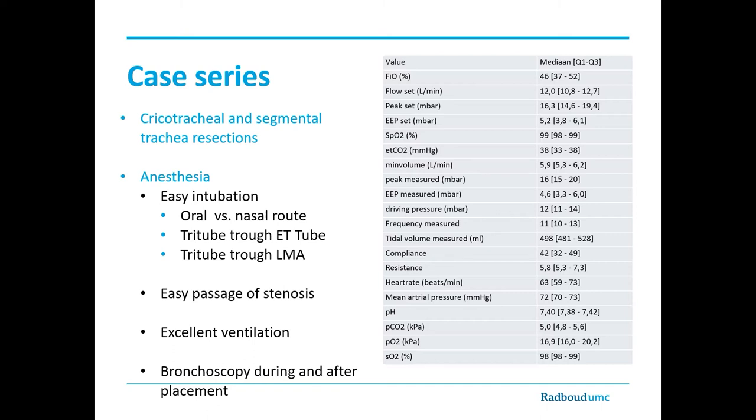and we found that we could more easily use bronchoscopy during and after surgery and placement of Tritube, because you can use the bronchoscope next to the tube and not via the tube, which we did before.